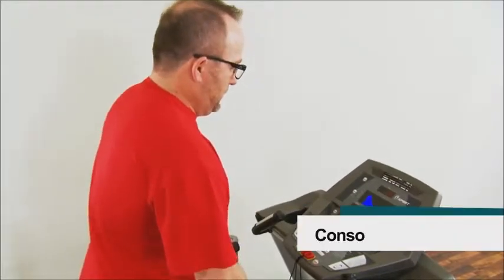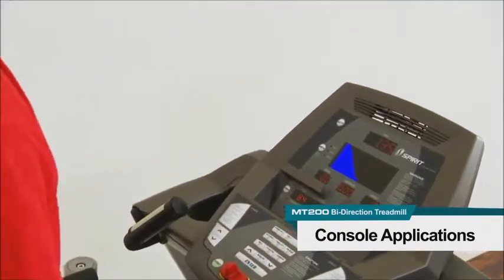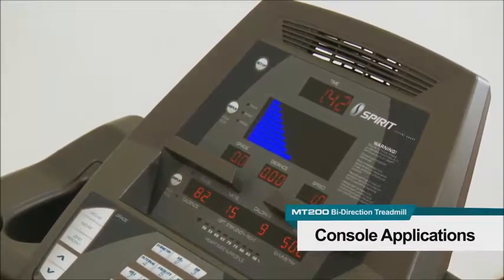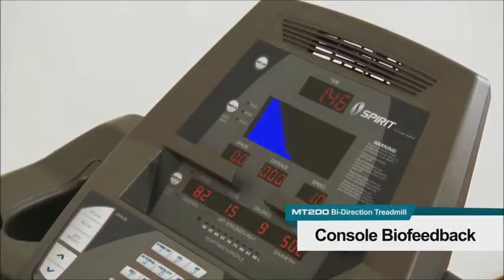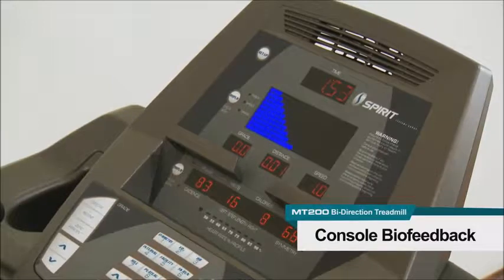The easy-to-read display provides real-time feedback shown through the LED display. The feedback includes time, incline and decline grade, distance, speed, METS, pace, stepping cadence, and step length. The symmetry program shows left and right gait information through a biofeedback graph and a numeric display window.